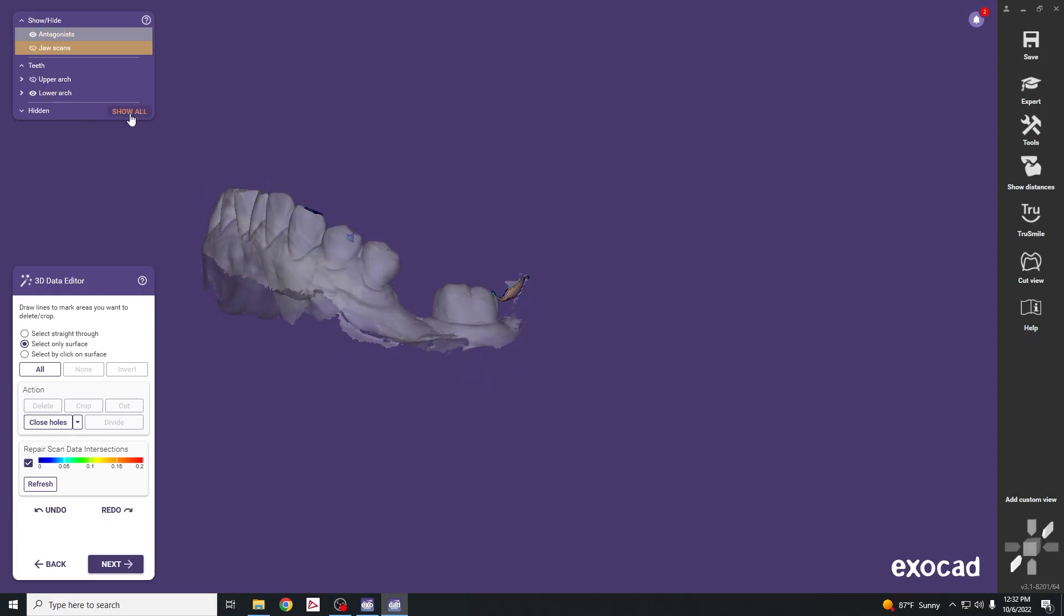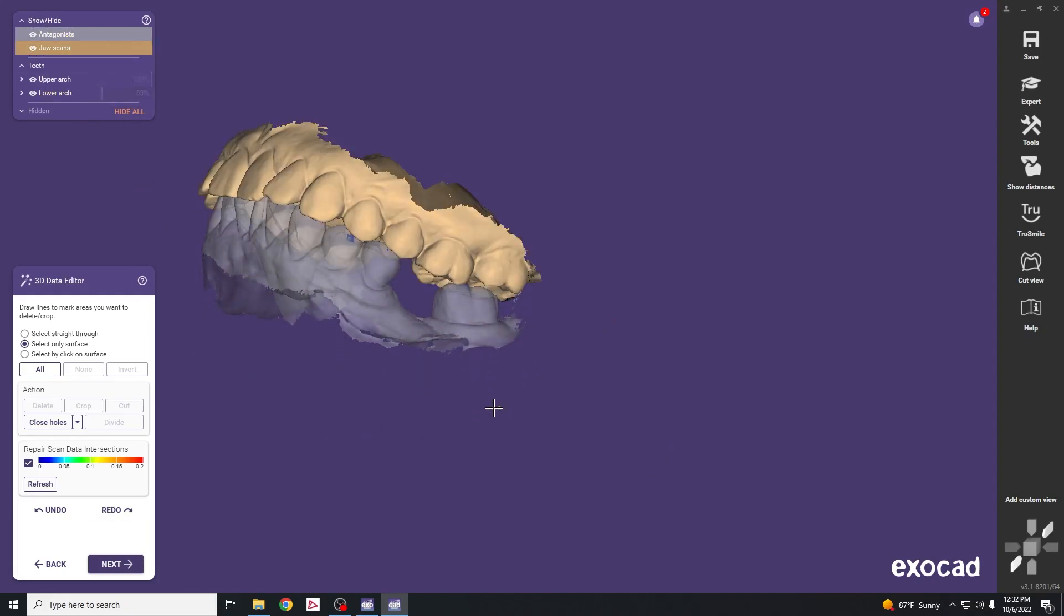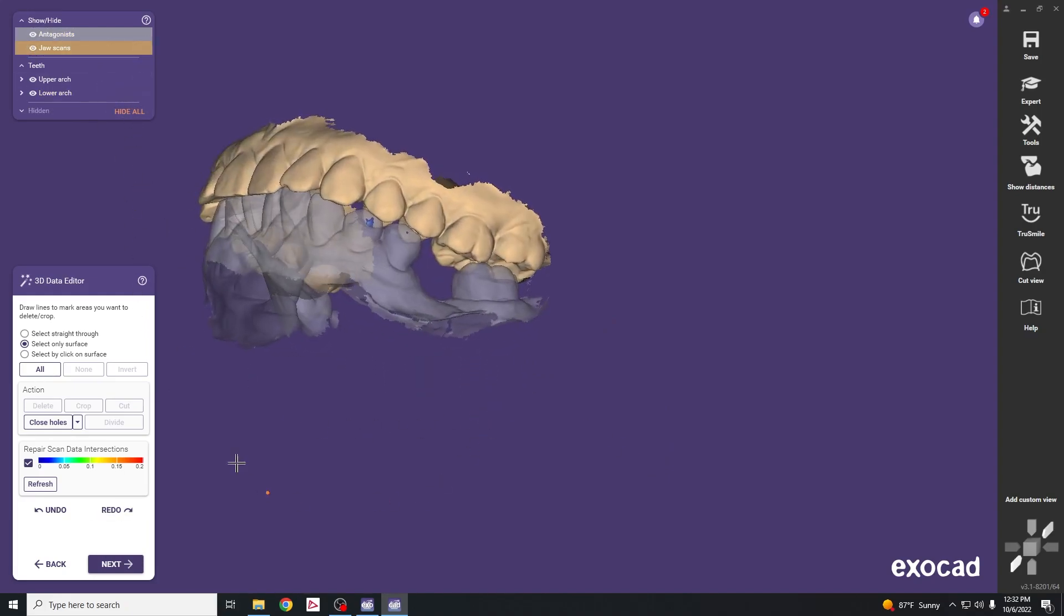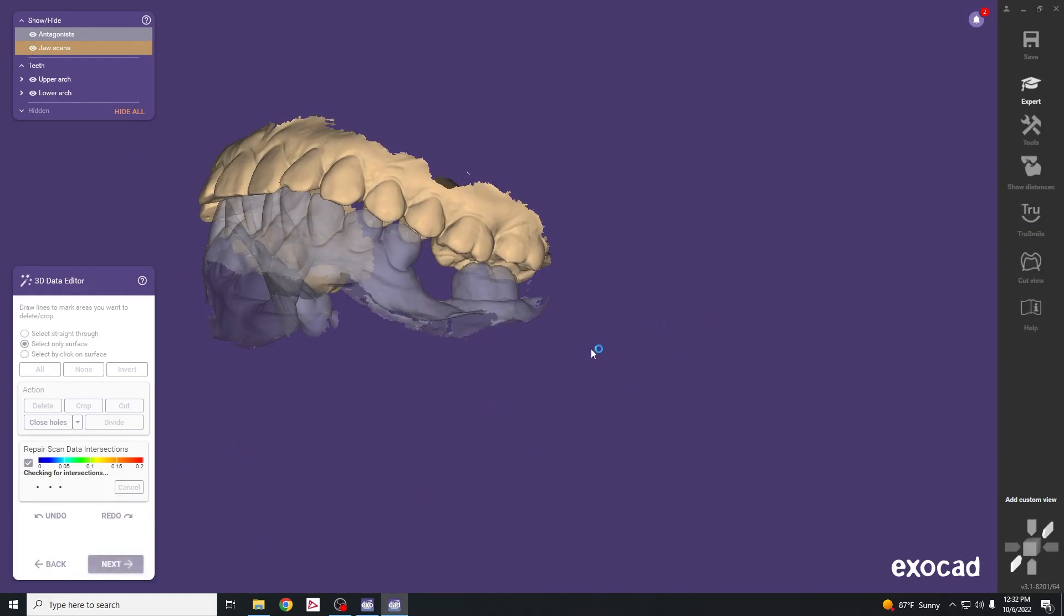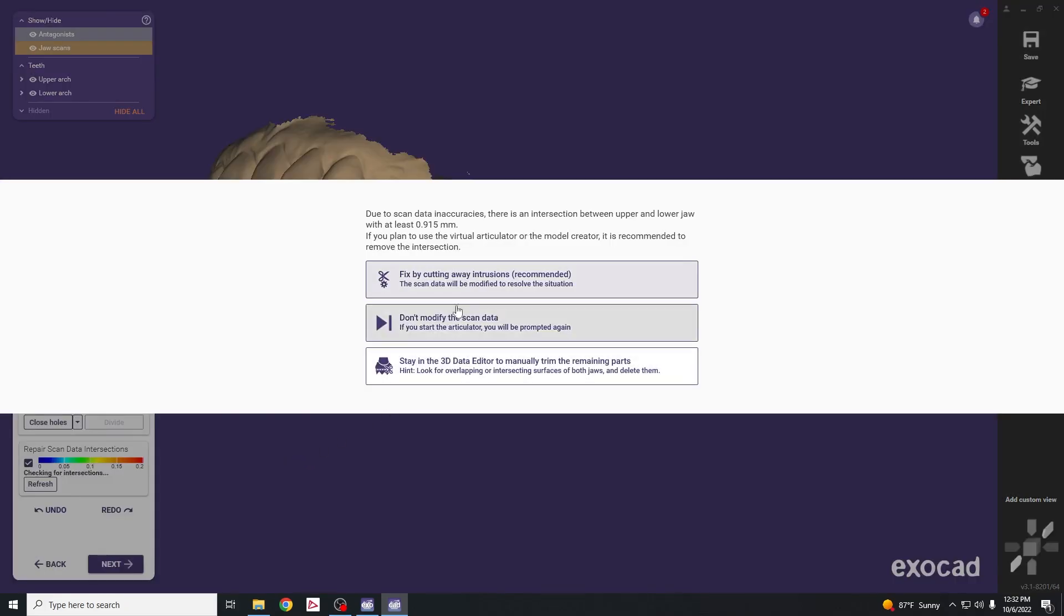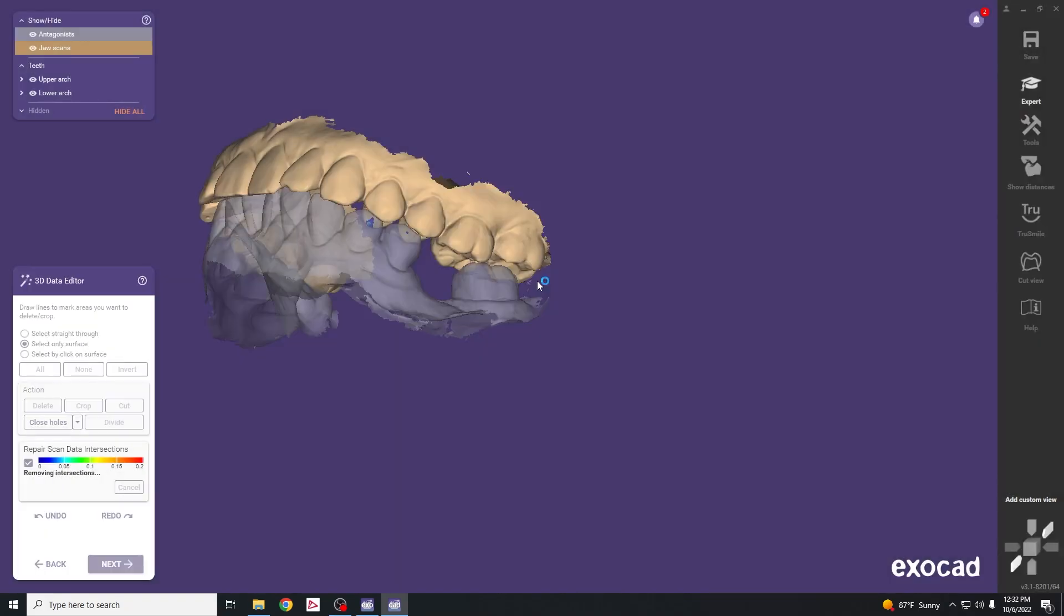This should allow us to get casts that articulate accurately. Hit next and it will ask us to cut away these intrusions, so hit the button that says recommended.